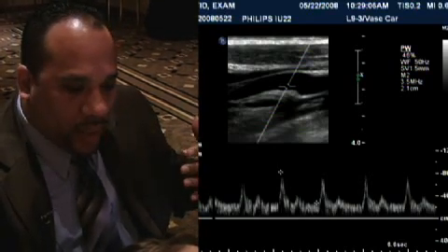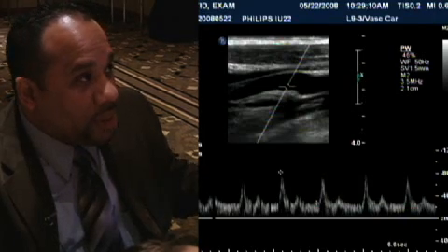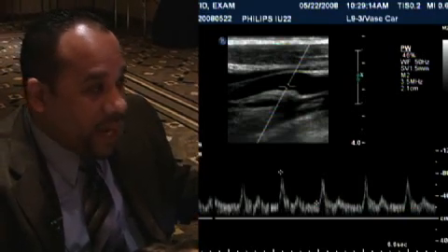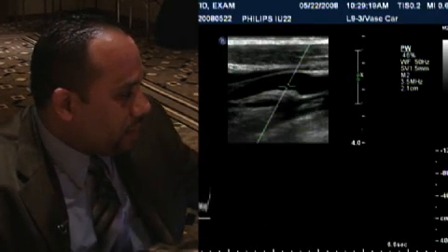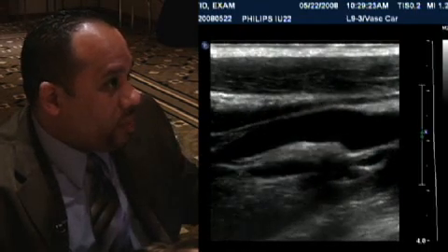And again, you'll be documenting all of this. In some cases, the machine will do it for you. You may be acquiring hard copy images. You may have a PACS system. But all this information should be documented and then provided to the interpreting physician for his interpretation.